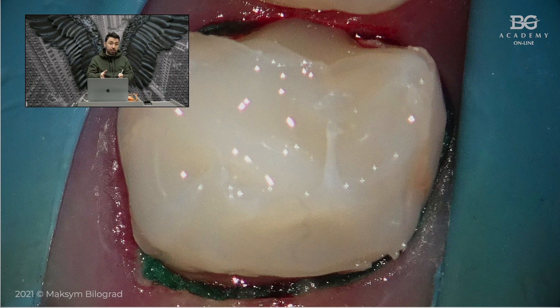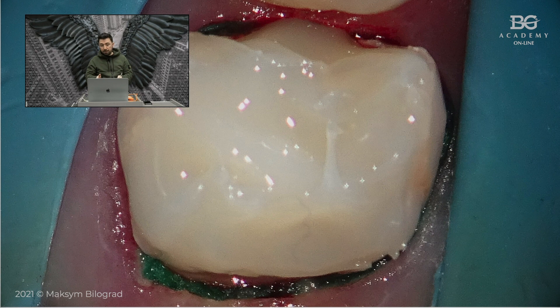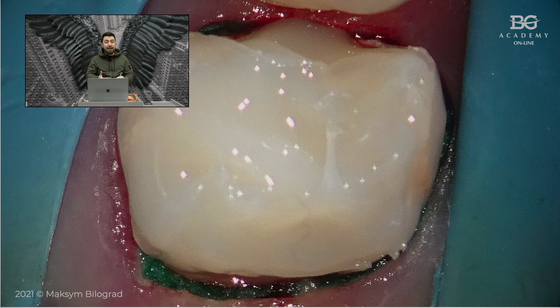If you forget to remove your flowable composite or liquid dam and then do the core build-up, it may bond to it and preparation will be more difficult. So we made this trick — we removed the barrier and went with our adhesive protocol, then injected the core build-up material. In this case I didn't use any matrix system because the material is not so fluid and I can control the injection. Then we light cured, waited a few minutes, and I was able to prep this tooth for the crown.